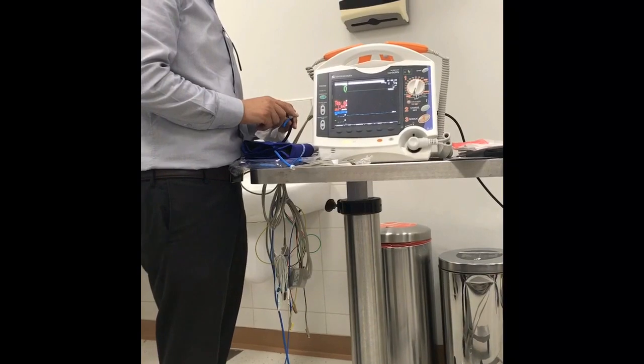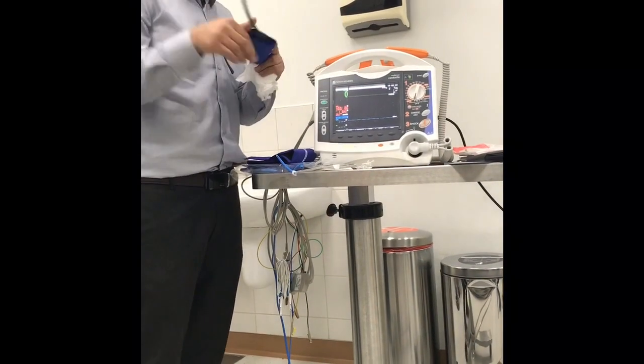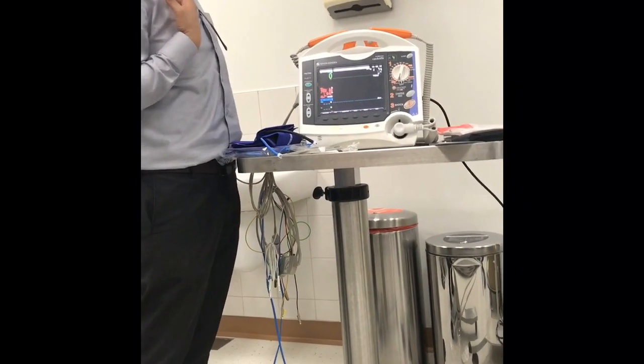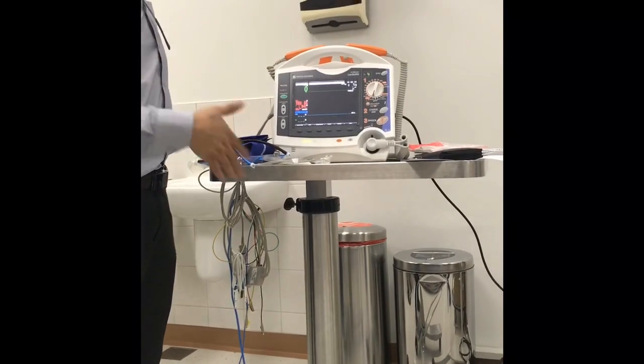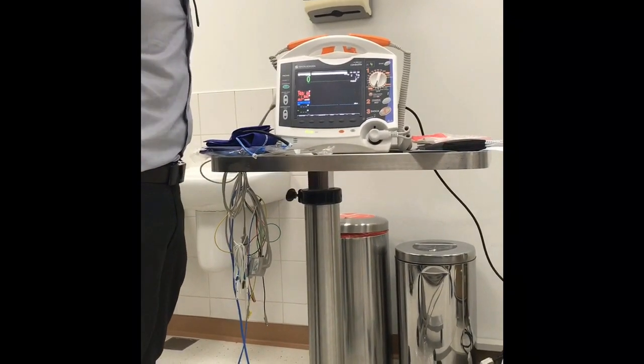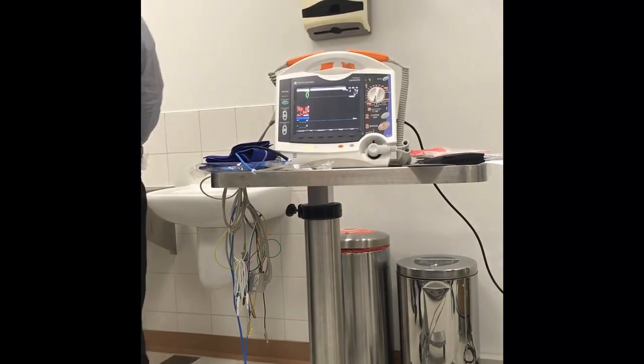But cuffs. You have the thigh cuff. We have the thigh cuff, yes. And neonate also? And neonate we have. We have all sizes, starting from 2 centimeters to 19 centimeters. So we have to request one. That's for neonate.